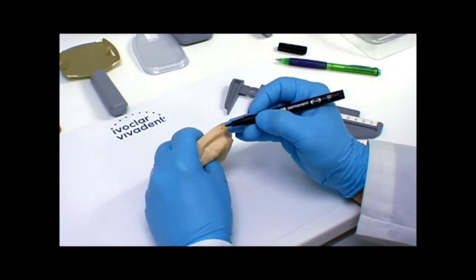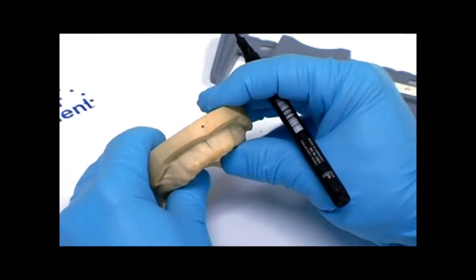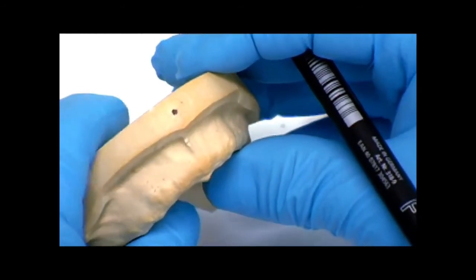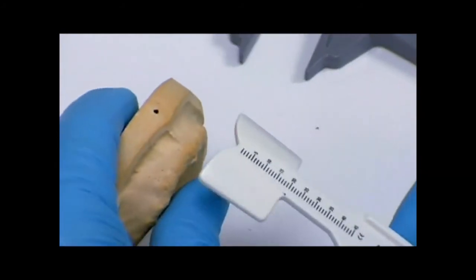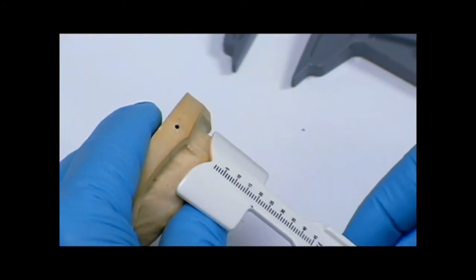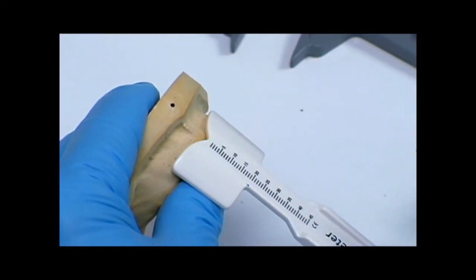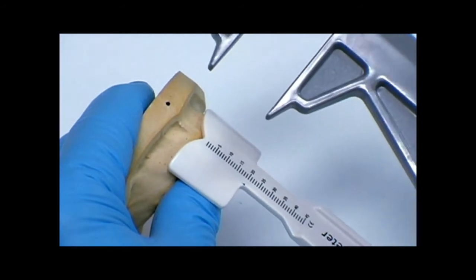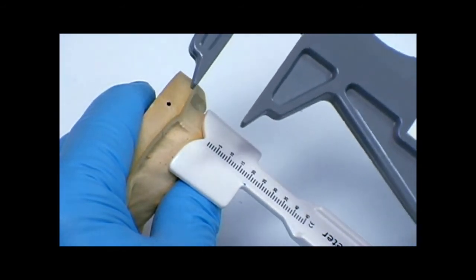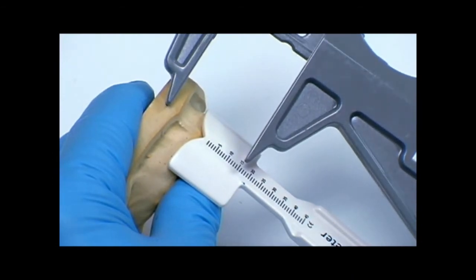First, we're going to mark a dot right in the midline position of our maxillary cast on the land area. And again, in the laboratory, they're going to also have a papillometer. What they'll do is rest it gently against the anterior papilla of the cast, and then take a measurement from this dot down to the 14 millimeters, which was the patient's low lip line.